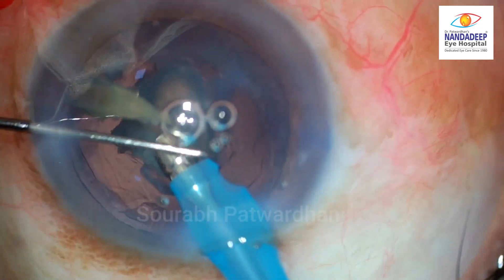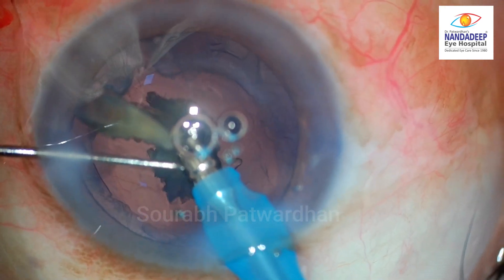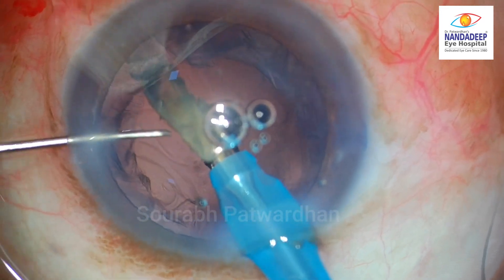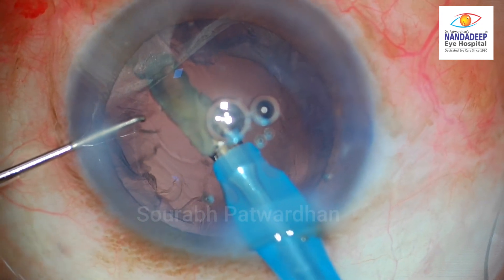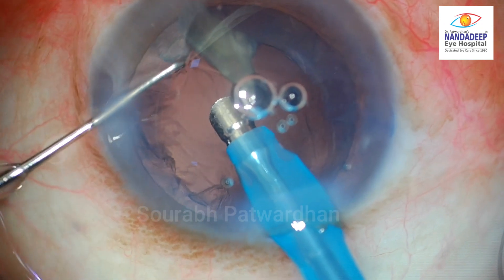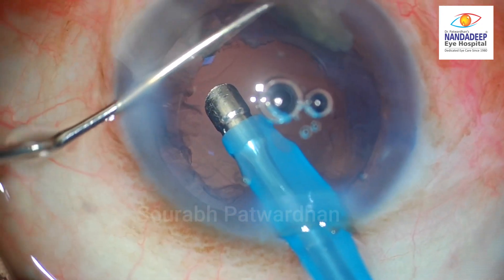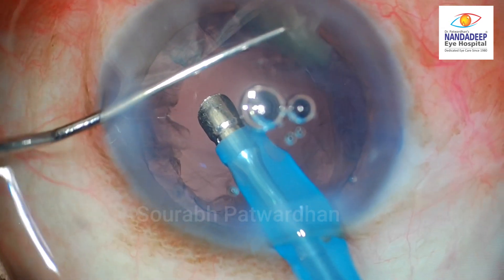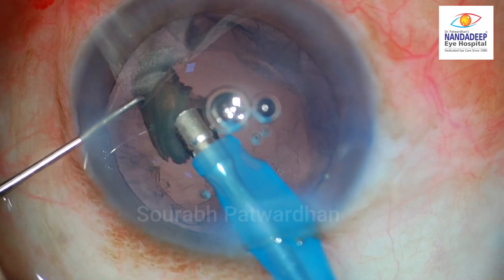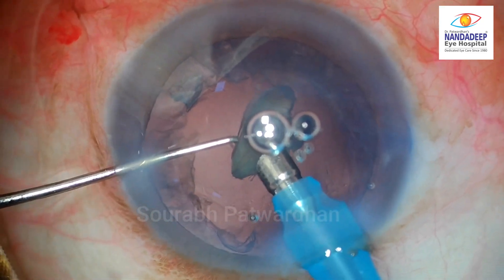The last piece is being emulsified — just look at the different things which are happening in the anterior chamber and make your observations. The surgeon is very, very cautious here, which is a good thing to do for the last piece, not in any hurry. I will try to closely observe what is happening.